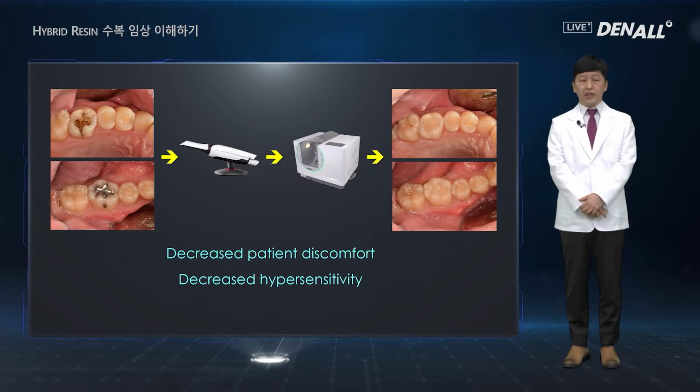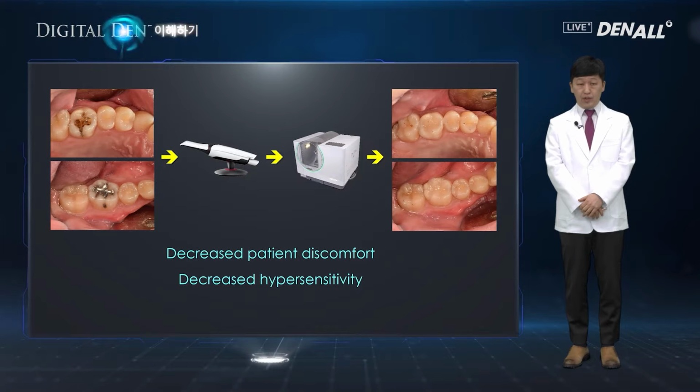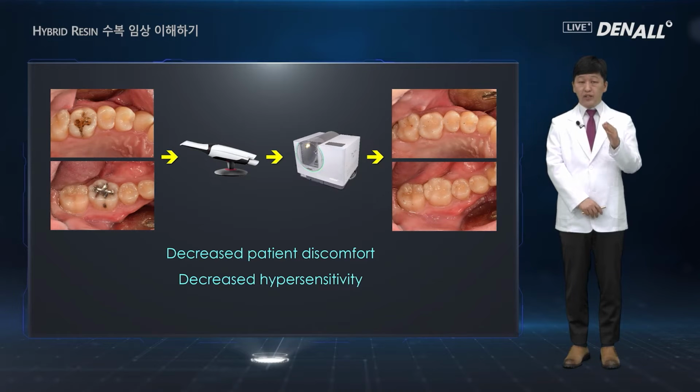Second, in the past, after inlay was bonded, a lot of patients complained of hypersensitivity. However, in using hybrid resin ceramic, such complaints have gone down drastically. I thought long and hard, and the reason is because the patient is under anesthesia when bonding is made, there is less pain.